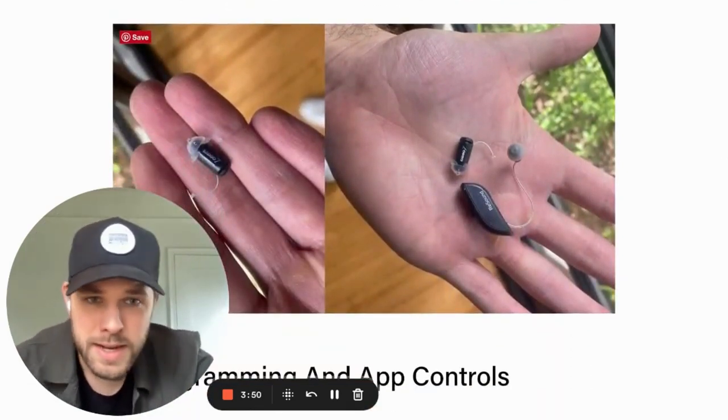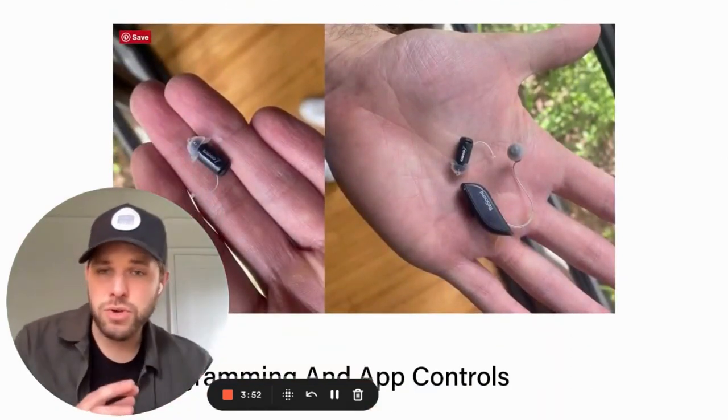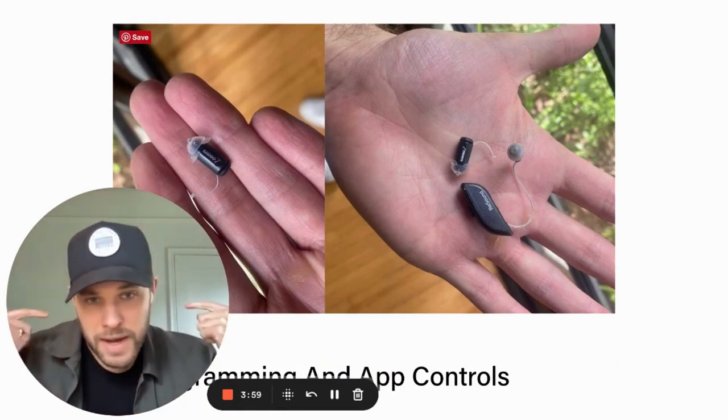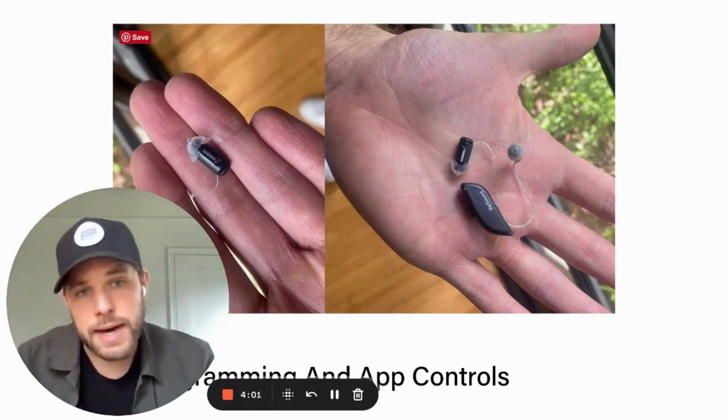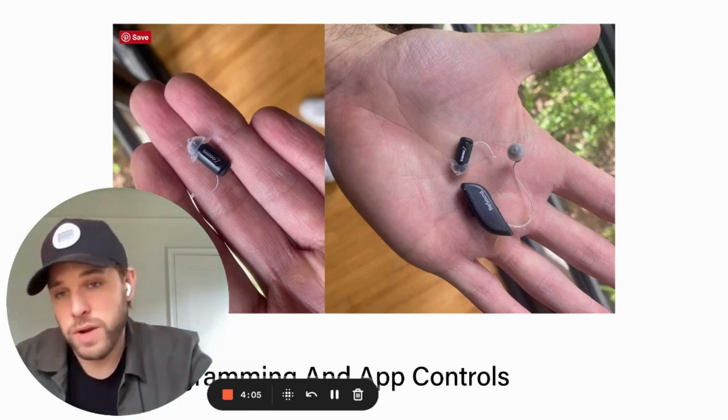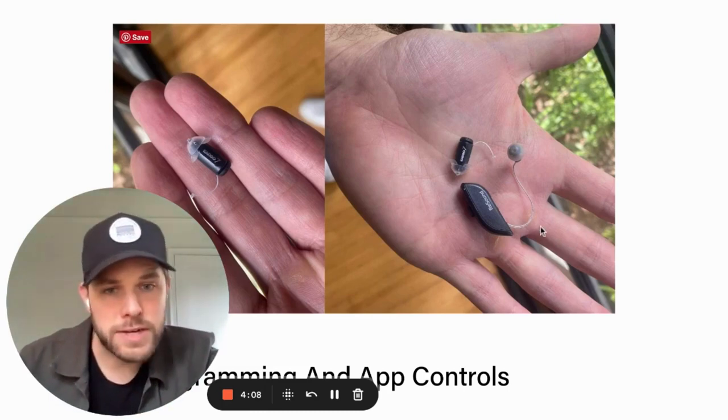This is another view of Eargo compared to a traditional prescription device — sitting next to the Resound Omnia, which I also love. The Resound Omnia sits behind the ear with a wire that comes up over the top, whereas Eargo sits entirely inside the ear. It's quite a bit smaller in general, just because of that form factor.